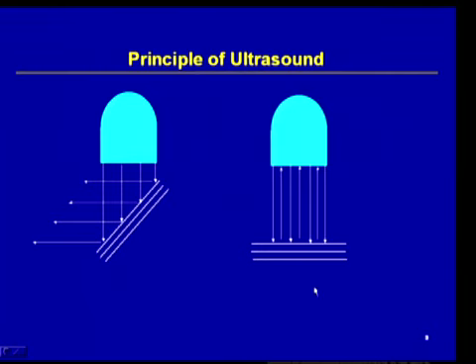And as you see in this image on the right, it is key that the transducer is held at all times perpendicular to the structure of interest. Because if you see here on the left, if these ultrasound waves are reflected back at an angle less than 90 degrees, then you will get a black image, and I'll show you that. That is a term that we call anisotropy.